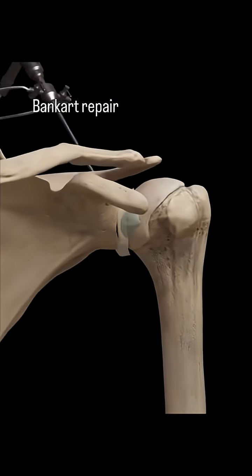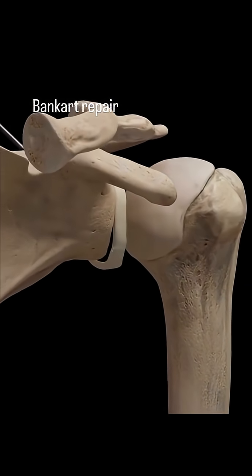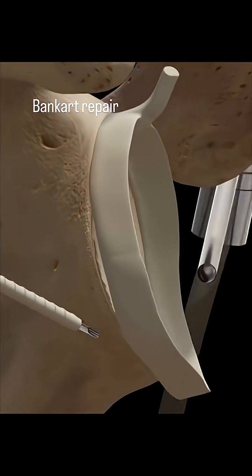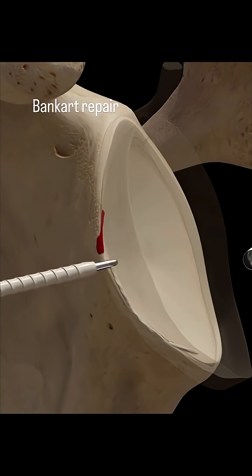Peeling back the layers, the view transitions to a skeletal model of the right shoulder joint. That same instrument is positioned to work directly within the joint space between the humerus and scapula. We see the joint capsule represented by a translucent blue structure, which is then removed to give us a clear view of the bone.